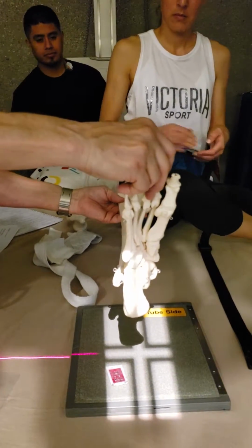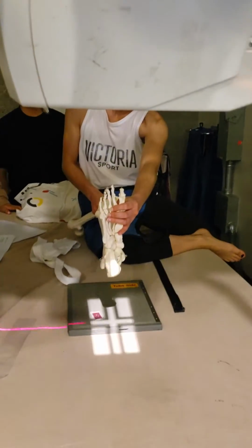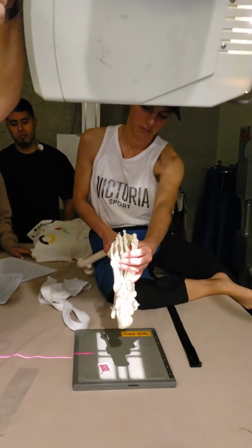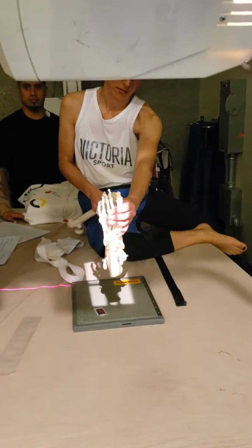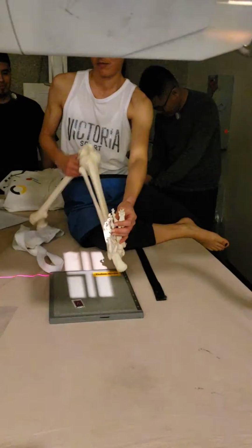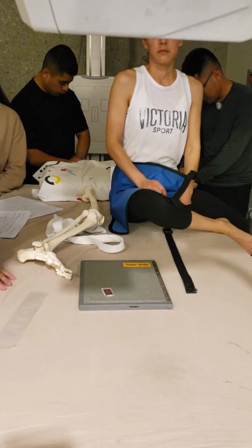Can you hold this for me here? Okay, the same thing will happen if you don't have the right tube angle. If you use less than 40, see how it foreshortens the calcaneus? Or if you use more than 40, it's going to elongate the calcaneus. So when you see an image that looks really foreshortened, they either used the incorrect tube angle or the foot wasn't dorsiflexed correctly. Okay? Make sense? So this is probably the one that you'll need to practice the most with because it's the newest, and the most challenging, I think.